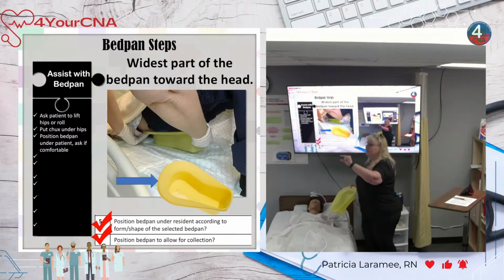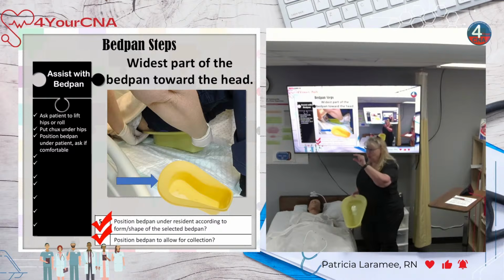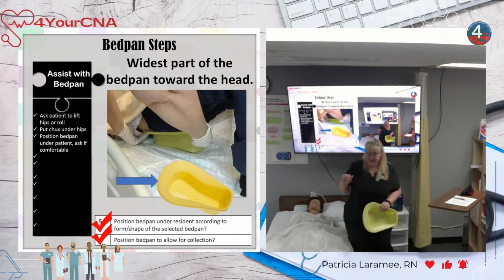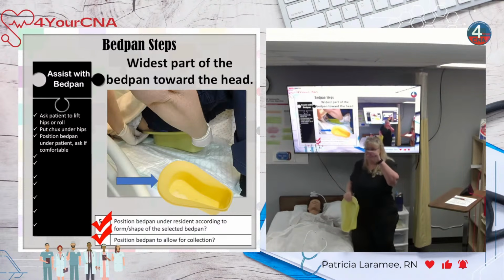We have liquid under pressure being forced out of the body, hitting a flat plastic surface this far away. Let me explain this to you guys, and there's no easy way to put this. Have you ever peed and had water splash back up on your bottom? You know the ick you get with that? Yeah, that water is this far away. We are working with this far away.